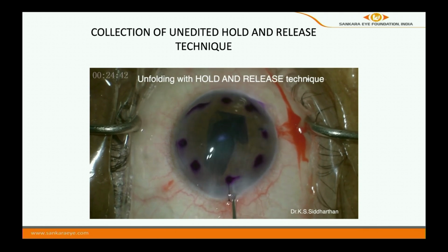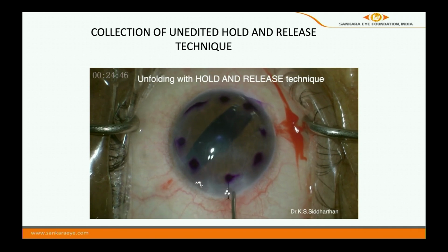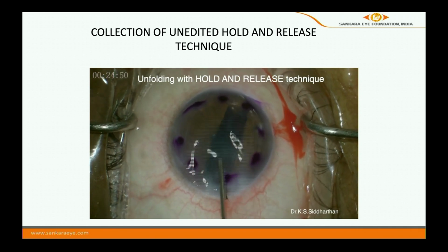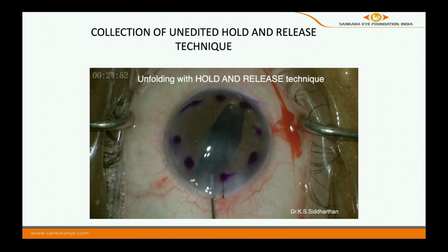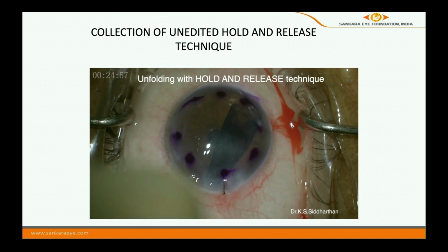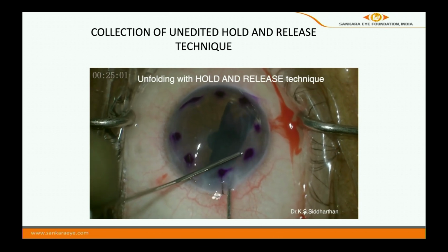Again here, see, it is scrolled. After I put a suture, I'm just showing this. You see 24 minutes. And now, again the same concept. You don't need to tap too much. Be very gentle. Just shallow the anterior chamber. Open it up. See which side you are in. Shallow it. Okay, just gently, just see whether it's on the correct side.